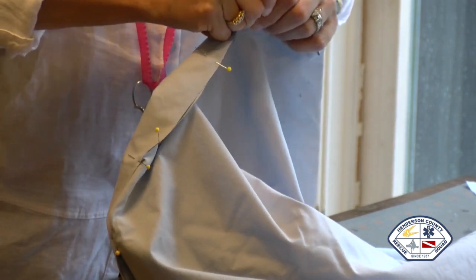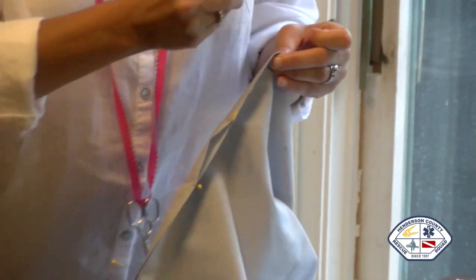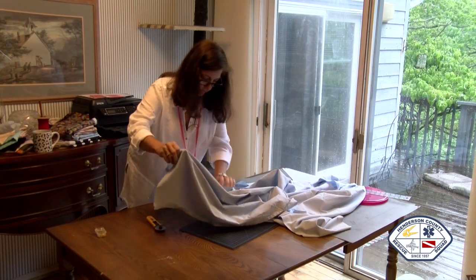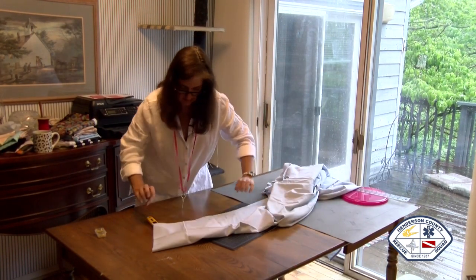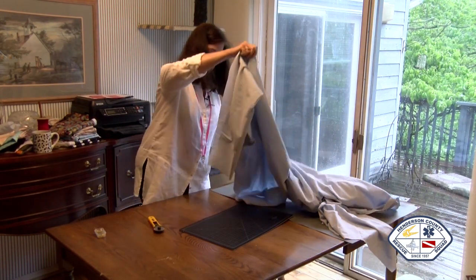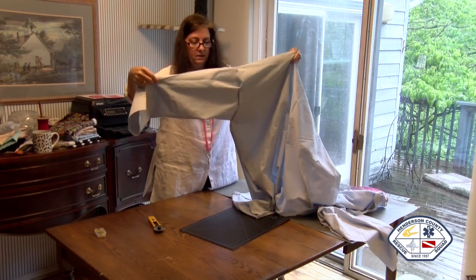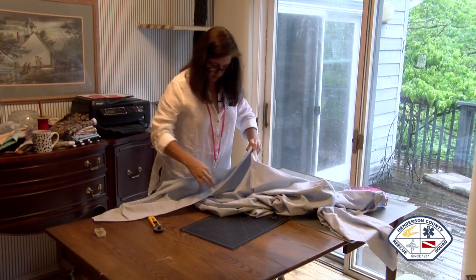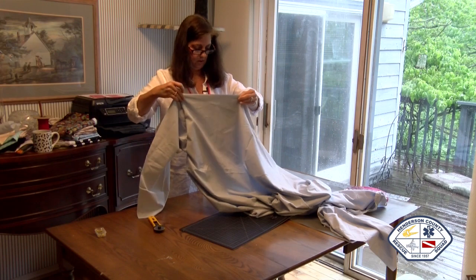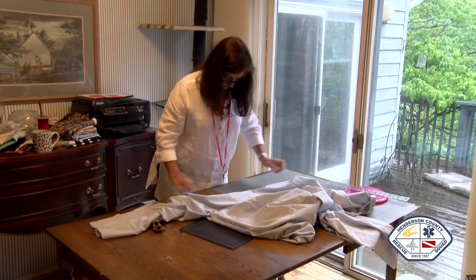Apparently I didn't measure real well, and one side's a little longer than the other, but that's okay. Shh, don't tell. This one fits great. Now, what we're going to have is a seam that goes this way, and the sleeve will come in. Perfect, like that. Great. Now, do the other side, and then we're going to talk about putting the neck in.